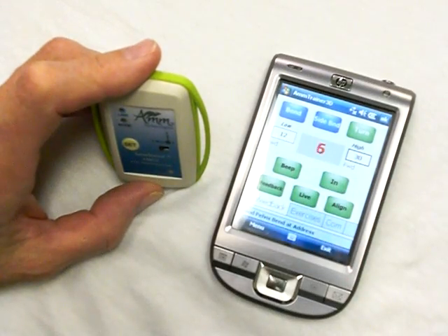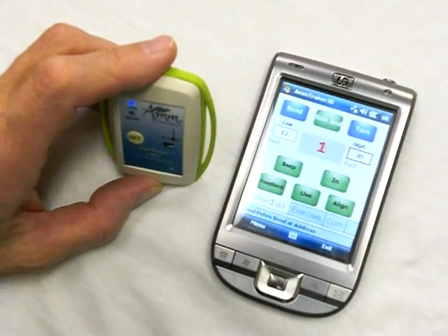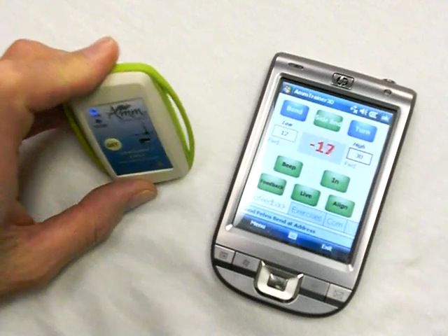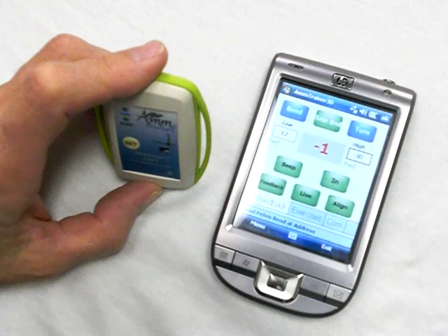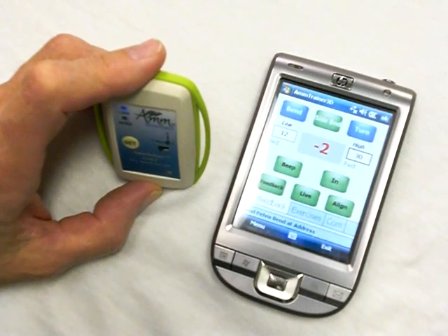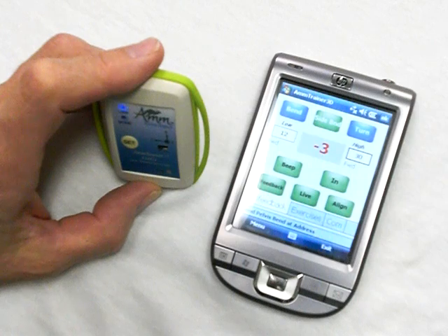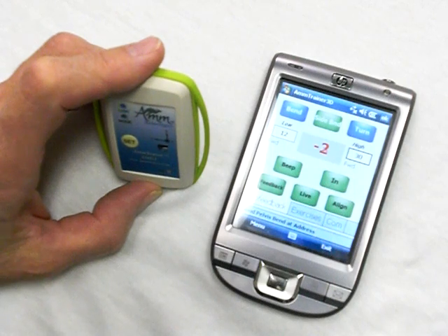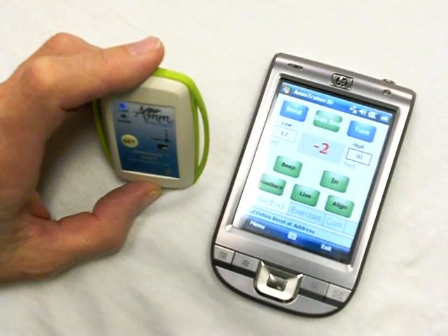Let's put it back in live mode. You can see I'll put it into side bend mode — so I can tip side. Three degrees of freedom: forward bend, side bend, and turn. The master application is on the laptop where you can design all your exercises, save them in a playlist just like iTunes, and download them to the PDA so you can have a set of exercises to do any time on the driving range, even on the golf course, or at home. All you need is the PDA and the wireless AM sensor.